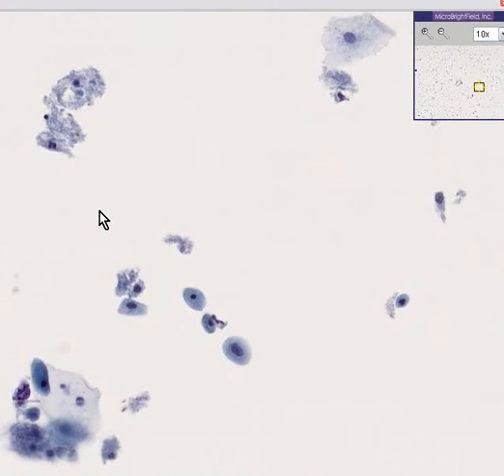This case is called Cervix Atrophy, and I think I'm going to try to show you why. Well, the first thing you'll notice is that this is not a tissue section. This is simply a smearing of cells. This was an exfoliation of the surface cells, the surface squamous cells chiefly, of the cervix, and it is stained with a certain stain that is named after a very famous person by the name of Dr. Papanicolaou. This is a pap stain.